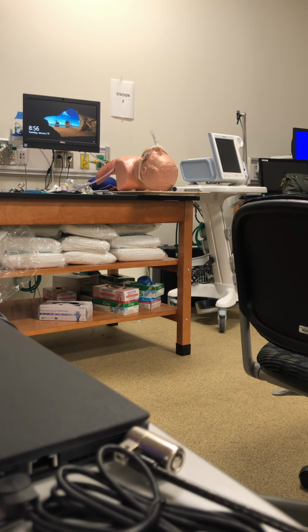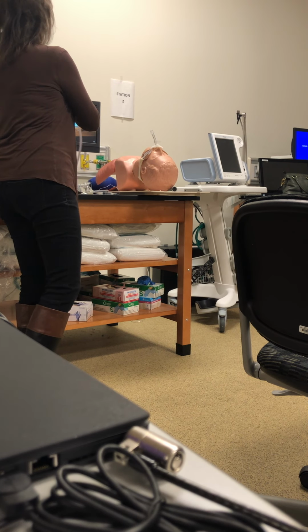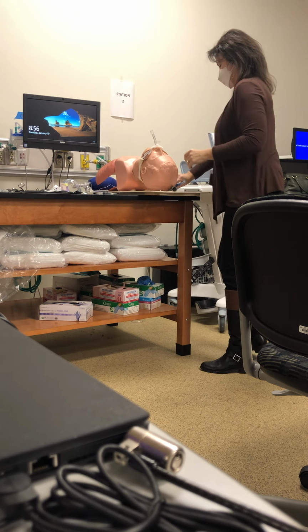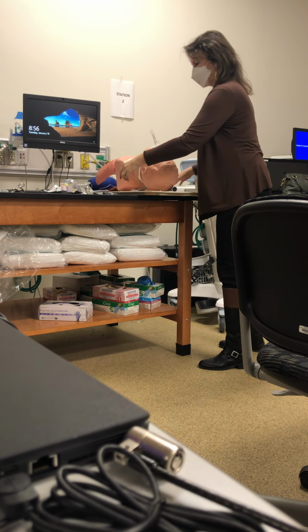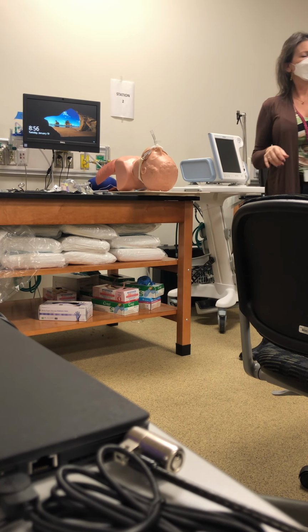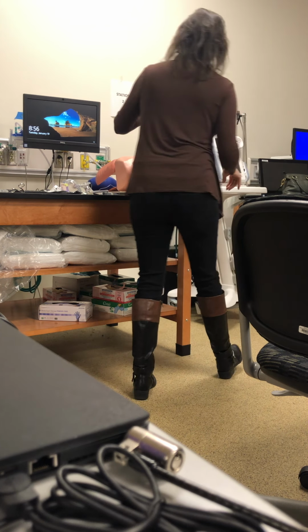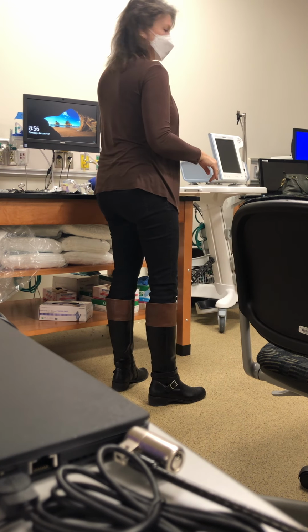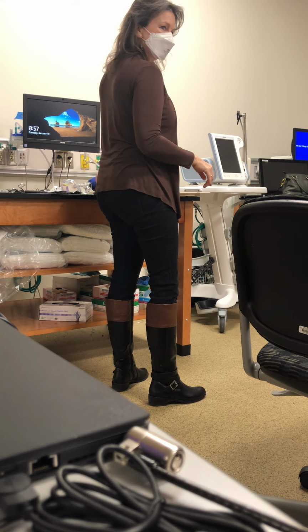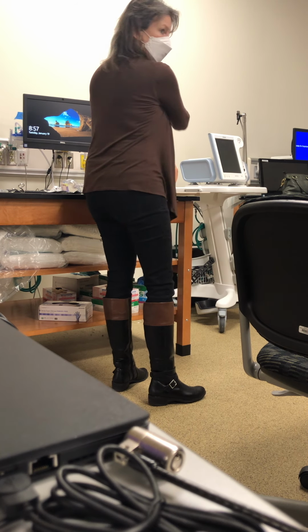So this is all the stuff you're getting ready, right? Checking your suction. I have good suction. I've got my tube ready. Okay, we're going to try to intubate. When we intubate, we're going to put the blade into the right side of the mouth and sweep the tongue to the left. You sweep the tongue to the left and lift up.